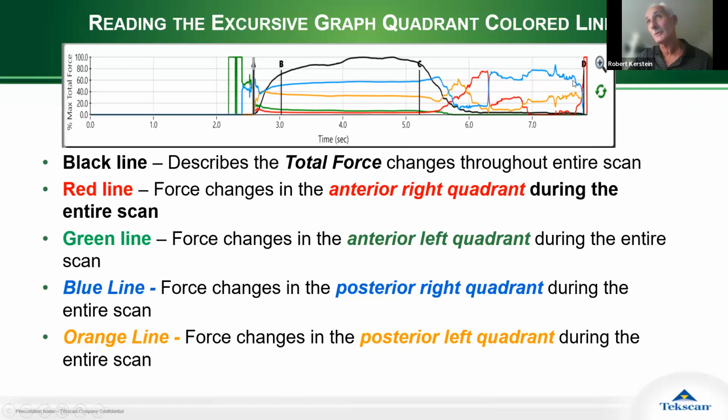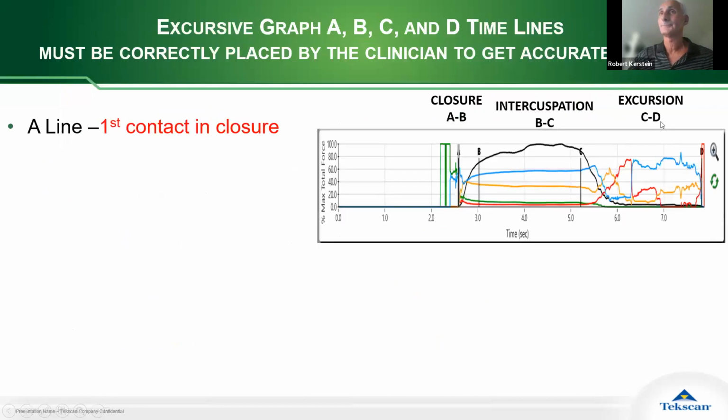And while that quadrant is operating, the posterior left is operating. So this is actually a very poor right excursion. This is a problematic right excursion. And that skill, understanding what's going on here, is something you, the user, need to develop.